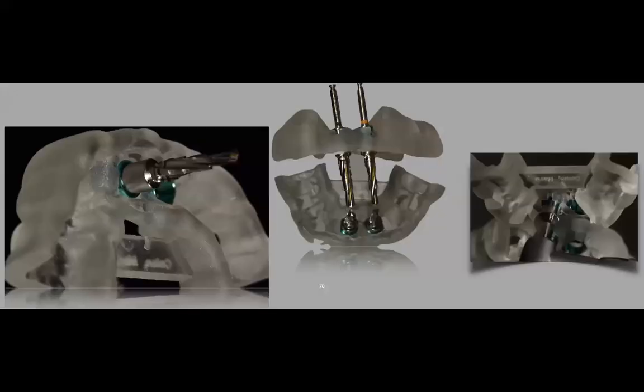So just to give you an example, take a look at this image over here. This is a 13 millimeter burr that's coming in, but you see this portion is smooth, which means it's not cutting. So probably the crestal bone is right here all the way down. Not probably, it's for sure. That's where the crestal bone is. This is all the soft tissue that this burr has to go through in order for you to be able to drill at the crestal bone. Here is another image. And here is an image of the stopper that you can go all the way to the end.